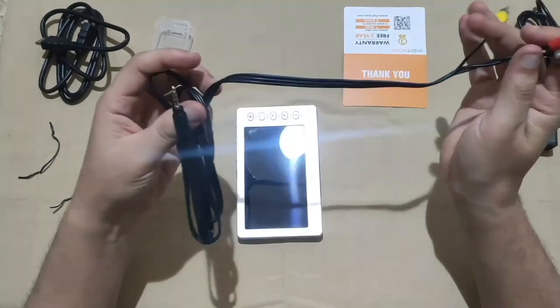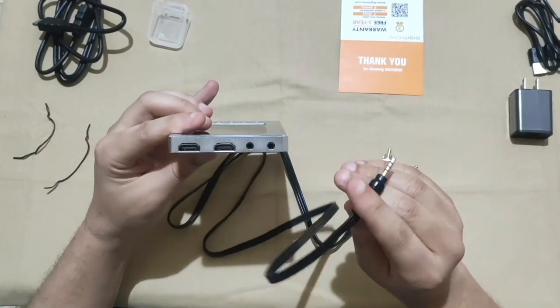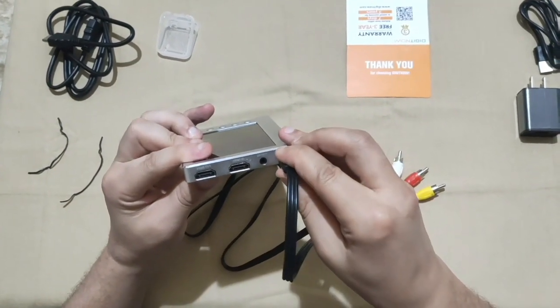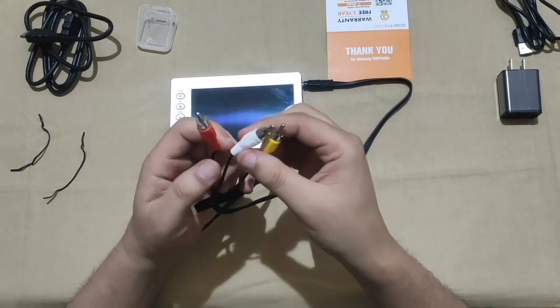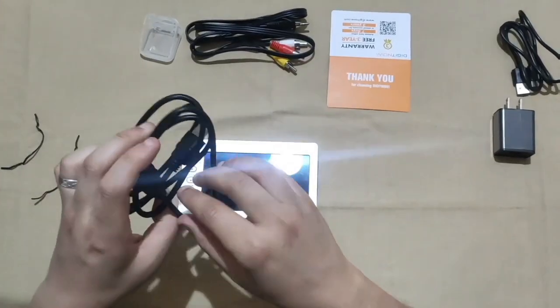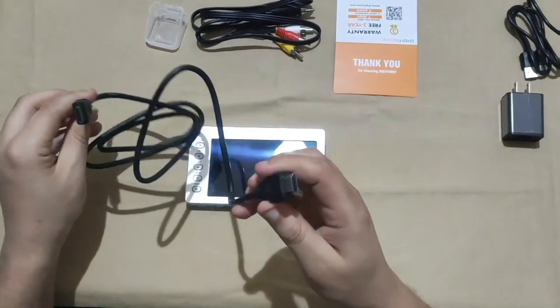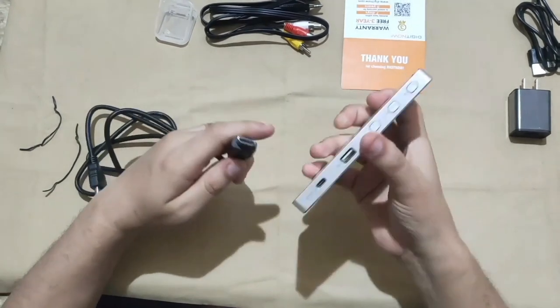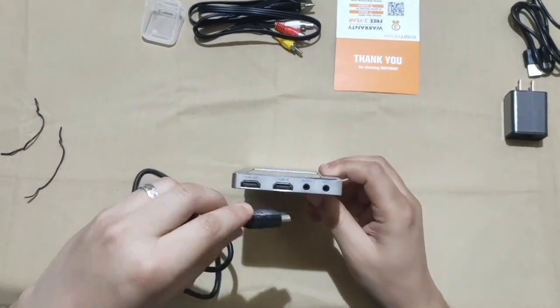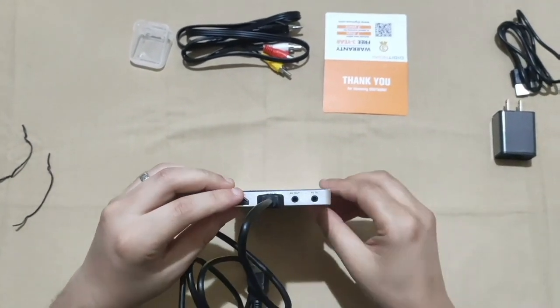To record from AV source, you can use the AV cable by plugging the cable into AV in of the capture device, and the other side of the cable into video source. To record from HDMI source, plug the HDMI cable into HDMI in of the capture device. And the other side of the cable into HDMI output of the video source.